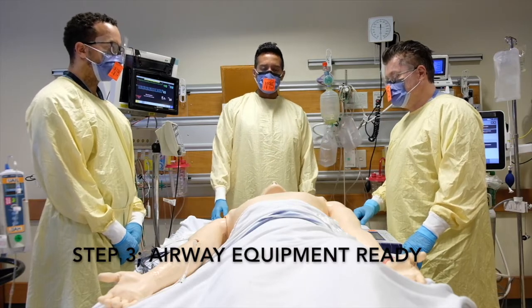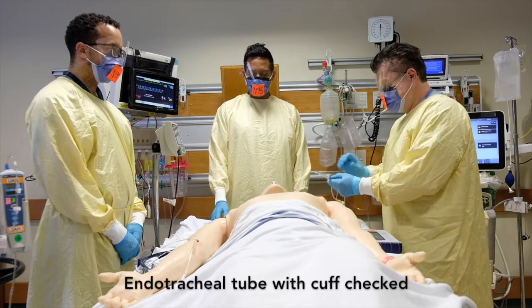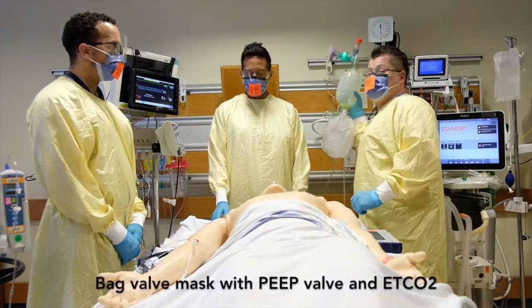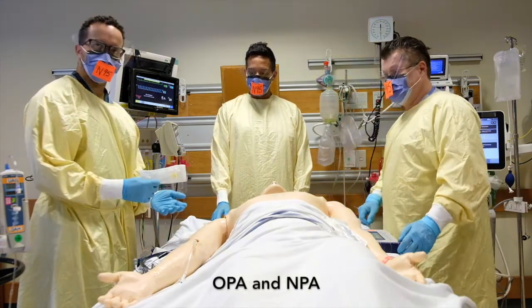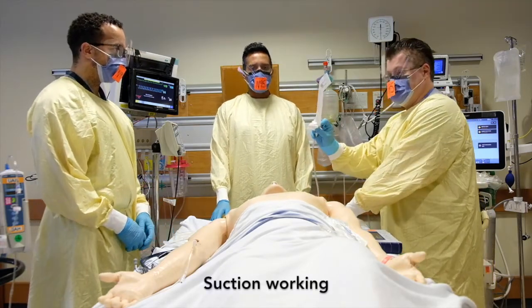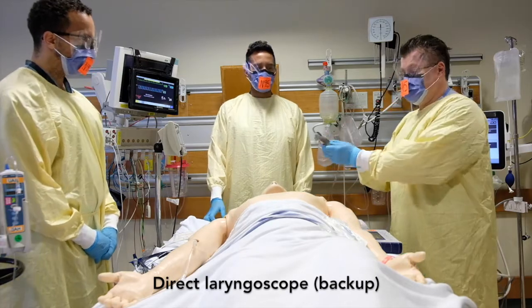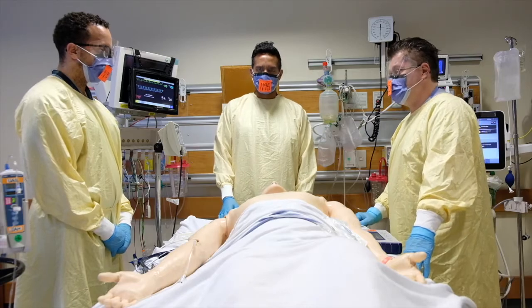So the next step in the checklist is to look to make sure that our airway equipment is ready. So number 1, do we have an endotracheal tube with cuff checked? And we have a 6mm backup tube. Perfect. We have a bag valve mask with oxygen, PEEP valve, and continuous end-tidal CO2. Do we have an OPA, an NPA, and we have suction available and working. And in this case, we'll be using glidescope for primary intubation, and we have a direct laryngoscope available as a secondary option. We have the high-risk airway part along with LMA outside if we have a failed airway.